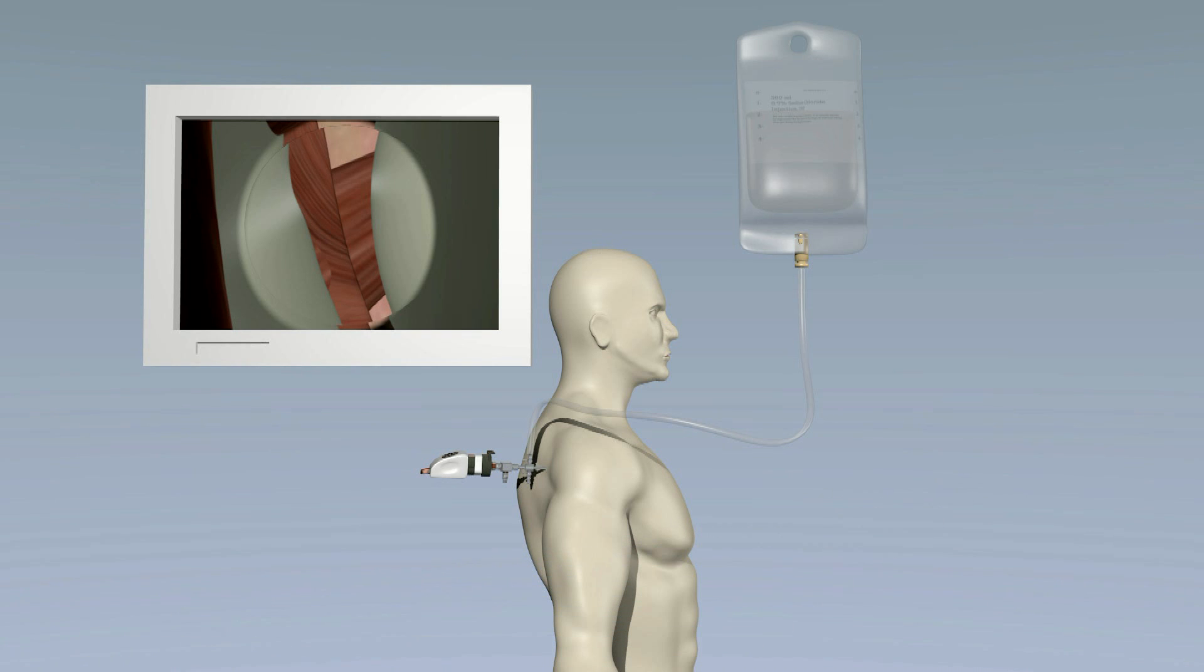A grasper can be used to grasp debris that is floating in the shoulder, such as small pieces of loose cartilage.